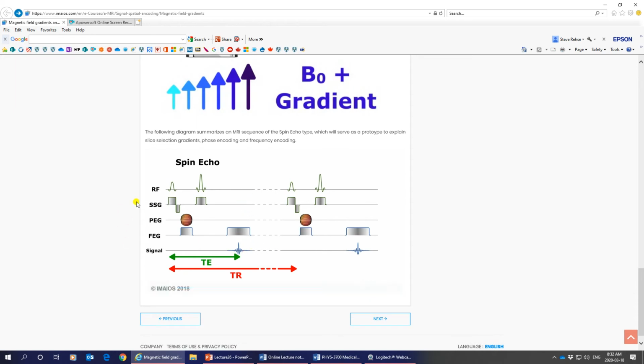It's got one line that you learned in the last lecture, which is what radio frequency pulses you're putting in. You put in a pi by 2 pulse, that starts the experiment always. Pi by 2, pi by 2. Usually it should be labeled 90 degrees or pi by 2. It's not here, but you should do that.